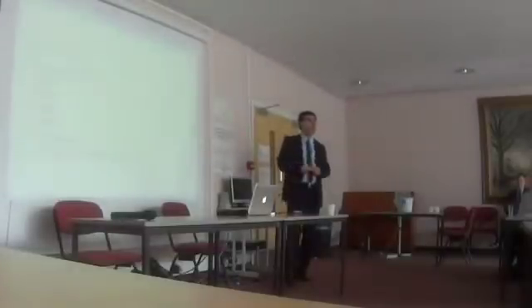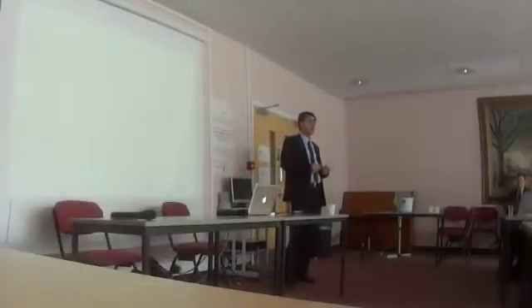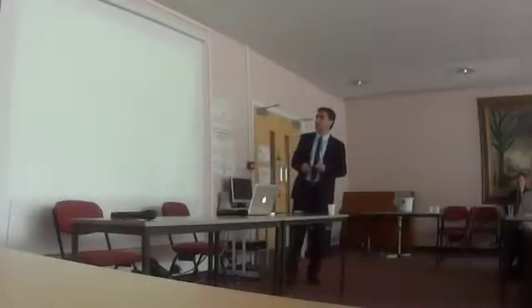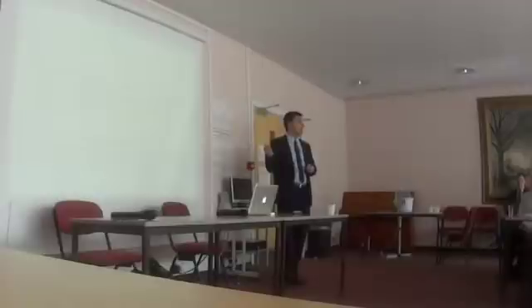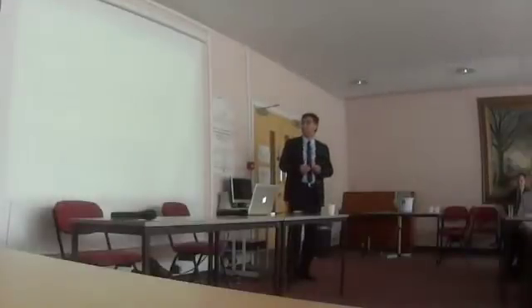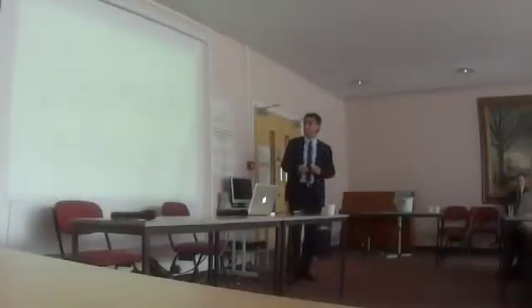For example, we can look at ischemic cardiomyopathy with the MRI. We can look at this in non-ischemic or dilated cardiomyopathy. We can look at hypertrophic cardiomyopathy and risk stratify, ARVC, and so on and so forth. Let's move on. Again, the presence of the scar, with delayed enhancement, that's the use of gadolinium, has significantly improved our knowledge in terms of the risk stratification and management of the patient in sudden cardiac death families.